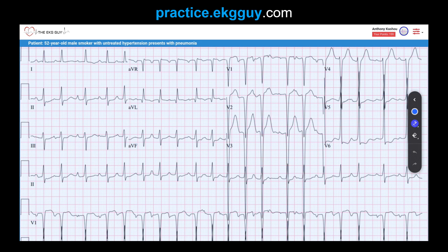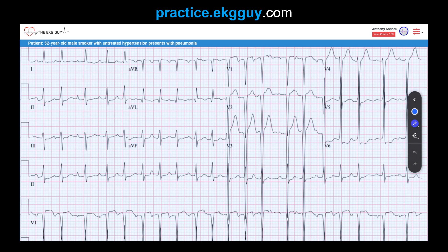The atrial rate is above 100 beats per minute. If we march out these R-to-R intervals, they are all different — this is what we call an irregularly irregular rhythm. Notice this interval here is shorter than the one that follows. The other thing to note is the P-waves present here.